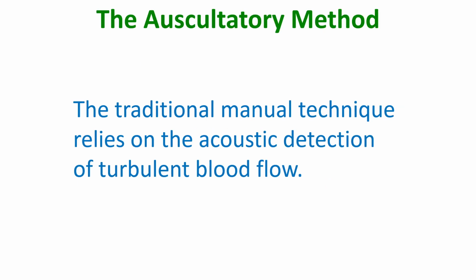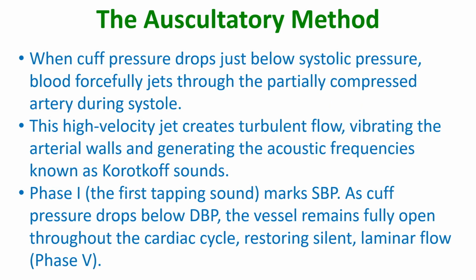The traditional manual technique relies on acoustic detection of turbulent blood flow. When cuff pressure drops below systolic pressure, blood forcefully jets through the partially compressed artery during systole. This high-velocity jet creates turbulent flow, vibrating the arterial walls and generating the acoustic frequencies known as Korotkoff sounds. Phase 1, the first tapping sound, marks systolic blood pressure.